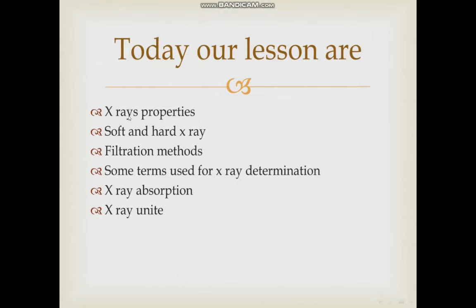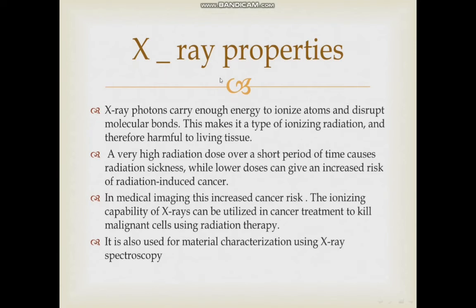Today I will lecture about X-rays. We will discuss X-ray properties, soft and hard X-rays, filtration methods, some terms used for X-ray determination, X-ray absorption and X-ray units.